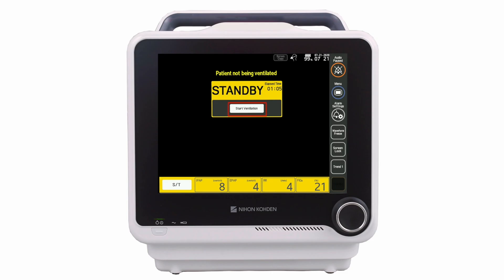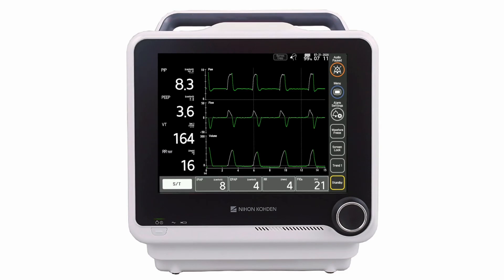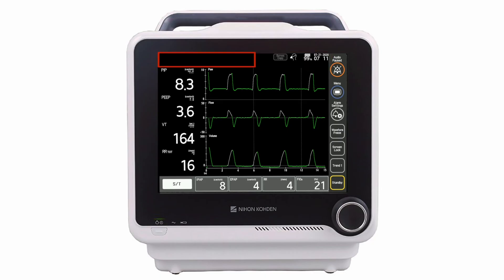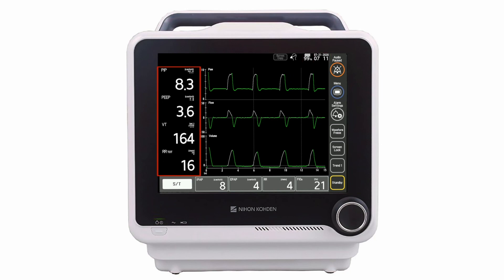The GUI is divided into five sections. The System Information section contains the alarm messages area, screen copy button, patient interface indicator, main battery status, and date and time details.